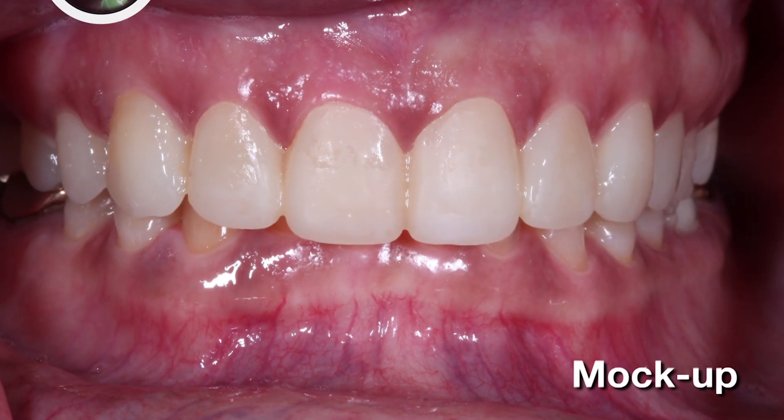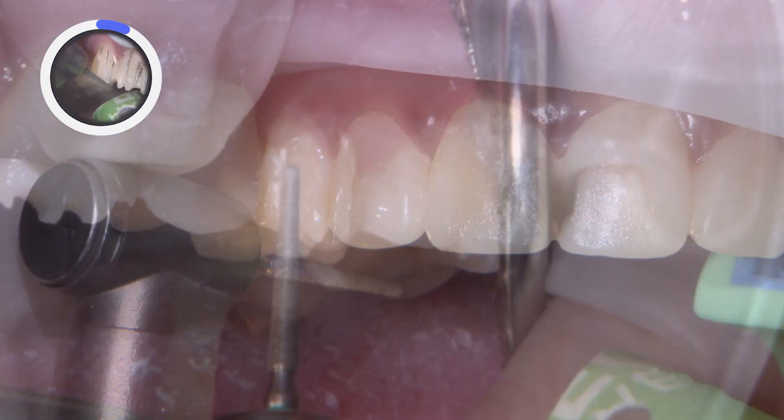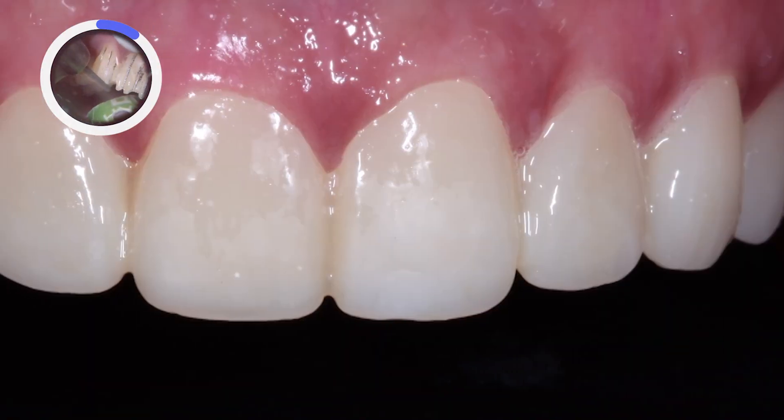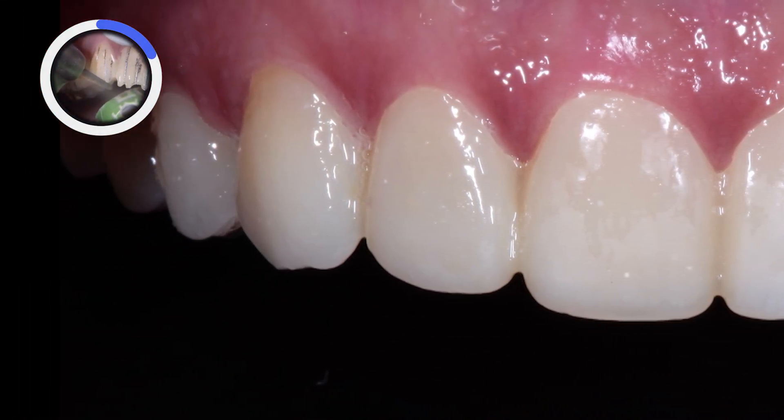I begin the preparation directly through the mock-up. By preparing through the mock-up, I'm able to ensure the final restorations have the appropriate material thickness while reducing tooth structure only in the areas that require it.